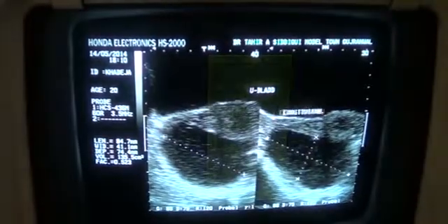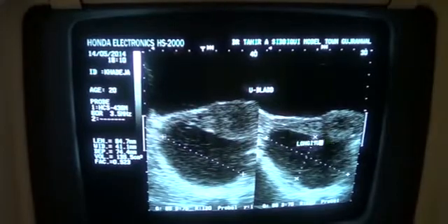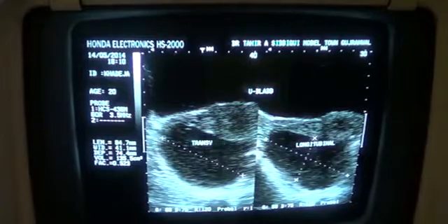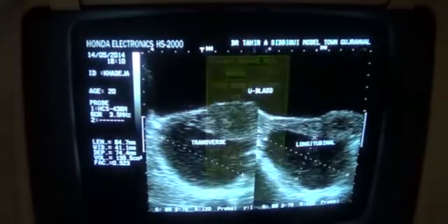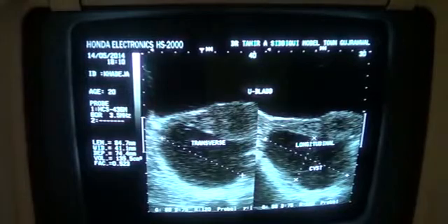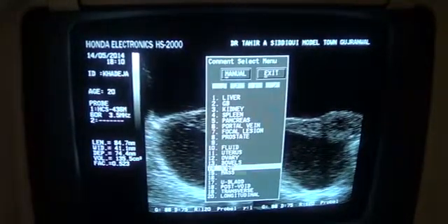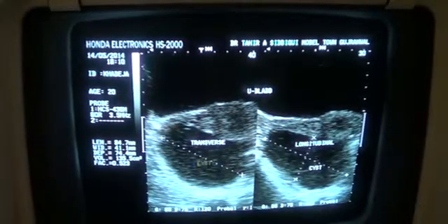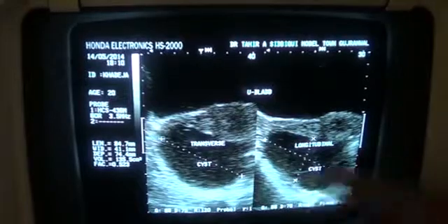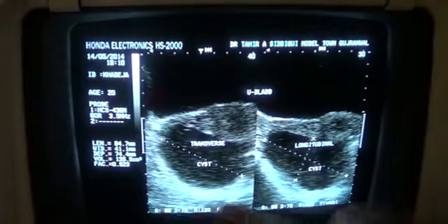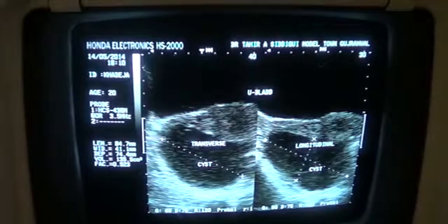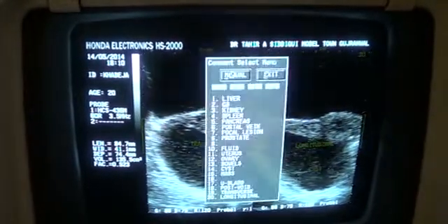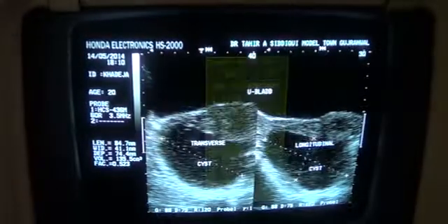So this is the longitudinal section and this is the transverse section, and this is the cyst — a cystic area. It has echoes within it, and there is posterior acoustic enhancement. No calcification, no solid element is seen. And this area is the uterus.